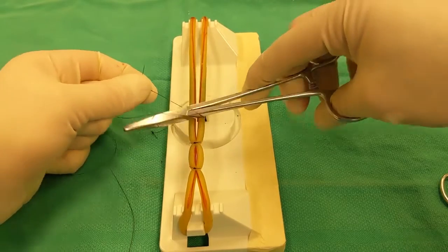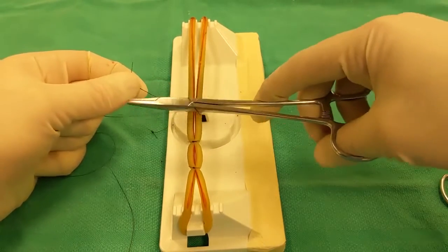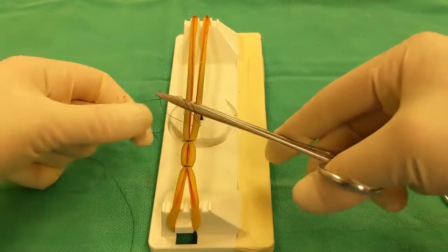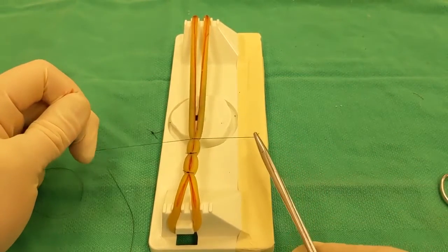So you go through it first, and then you wrap that needle strand of suture around your instrument, and then you grab your suture tag and pull it back through that loop and tighten.